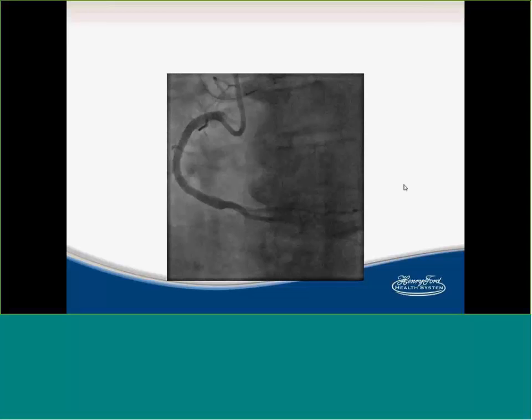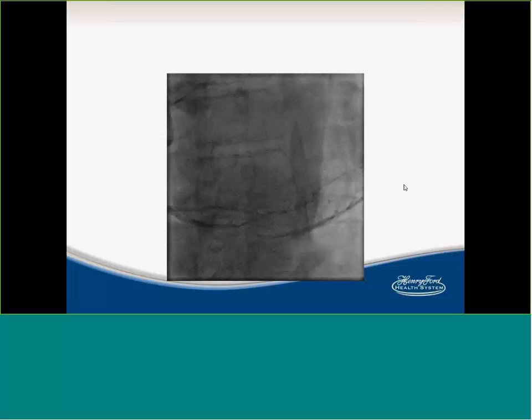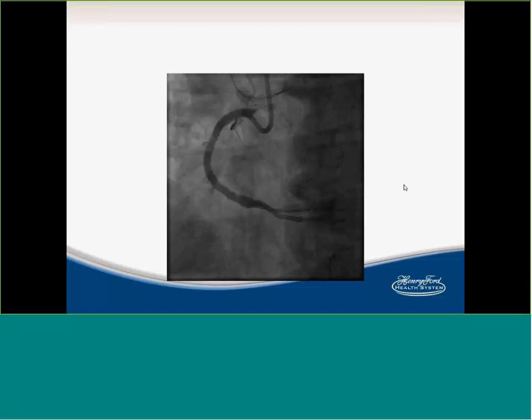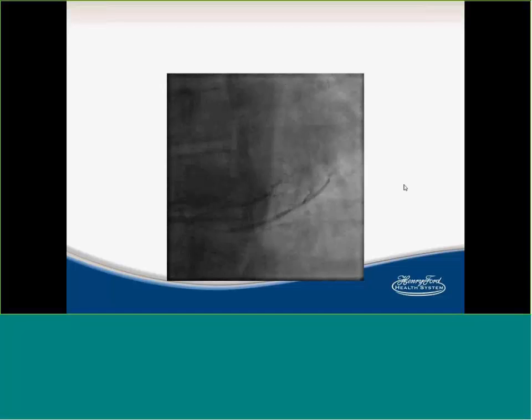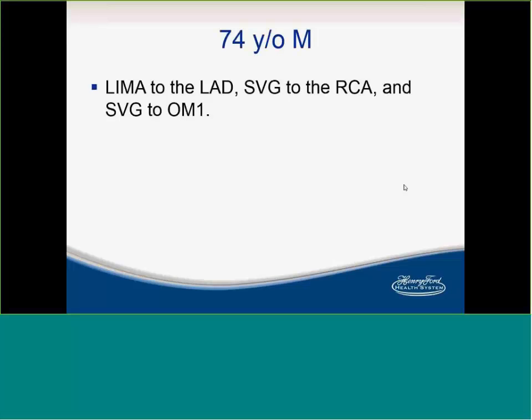So this is a case about how to do retrograde access and what to choose, the techniques, and once you've done retrograde and want to do bifurcation stenting, what kind of problems you end up facing and how to go around them. And I think there's a lot of interest lately, Carl, in preserving all the side branches. In the past, we said just open one branch and you'd be okay, better than nothing. But we're increasingly seeing that if you recanalize all the major branches at least, you feel better. You have less ischemia and less stenosis because of better outflow from the vessel. So the latest trend is to go for complete revascularization and keep all the major branches open, as you just did in this case.